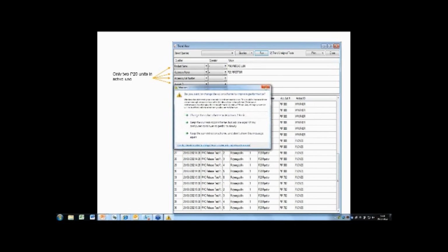These query qualifiers show us that there are 2 pipettes in use, PIP 008 and PIP 782, and the only one that's being used by P. Jones is 782. He's also using 008, but he's the only technician using this pipetter. So again, it points us in the direction that there's potentially a problem in this area.